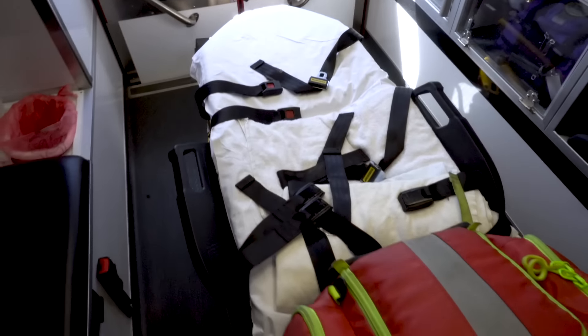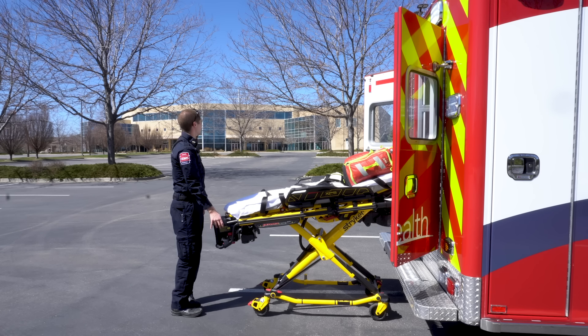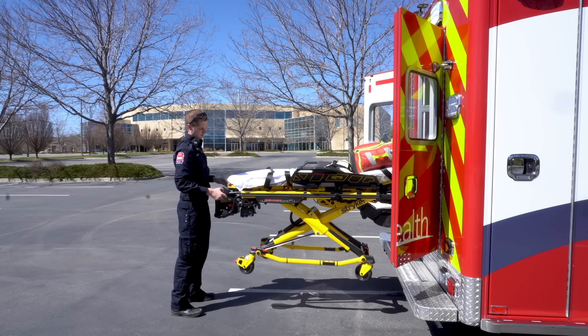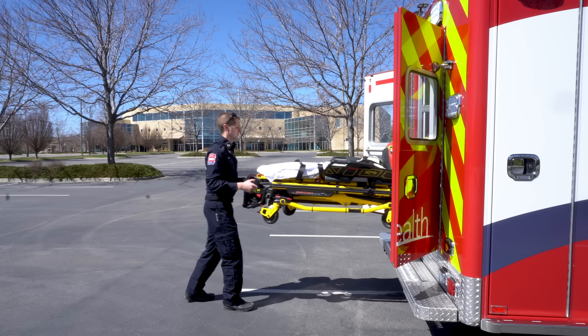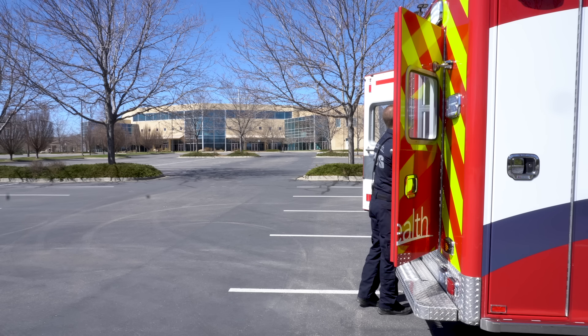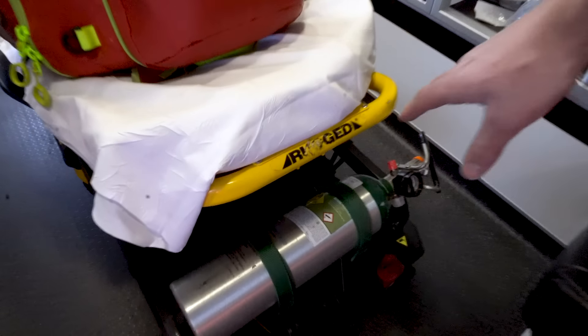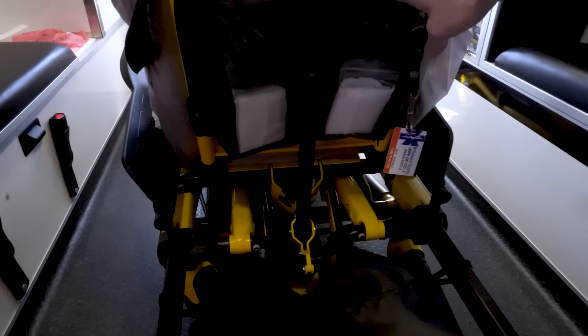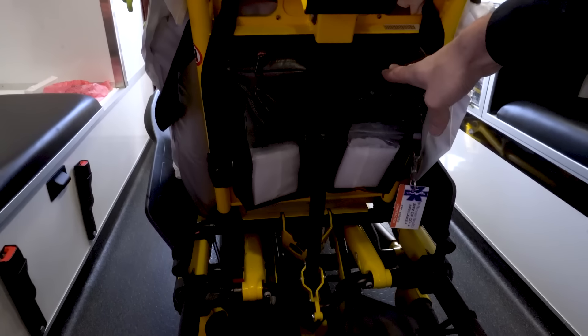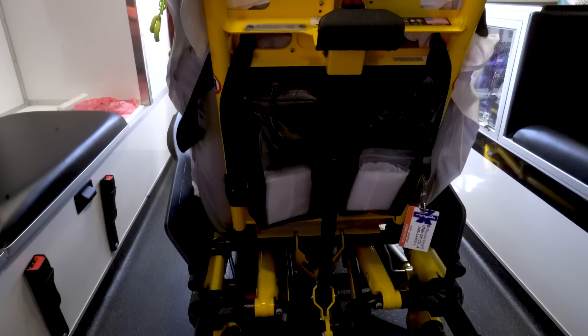We are using the Stryker autoload cots — these are super nice. They have the ability to load 700 pounds without the provider expending any effort, and they're in every single truck we have in our fleet. They really reduce workplace injuries. On the back of the cot, we've got an O2 tank that can be hooked up to the patient, and then we have two bags with some spit hoods and emesis bags just in case.